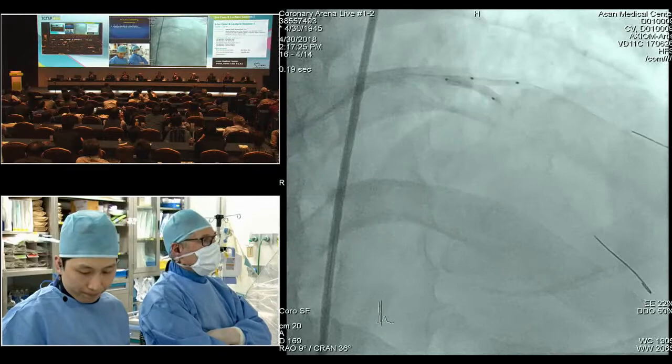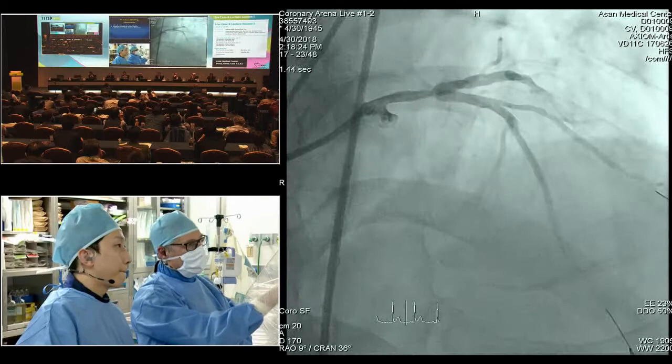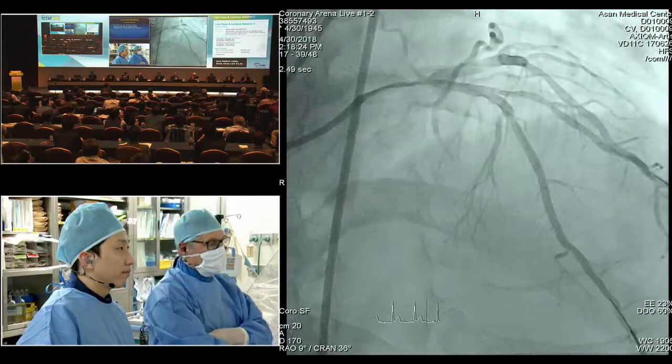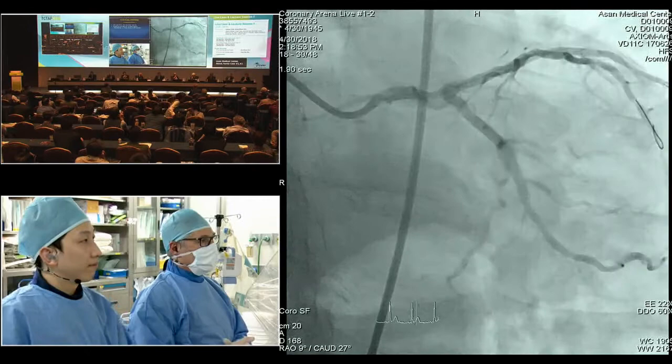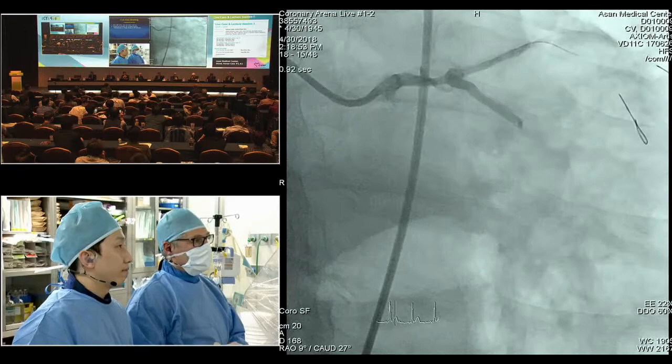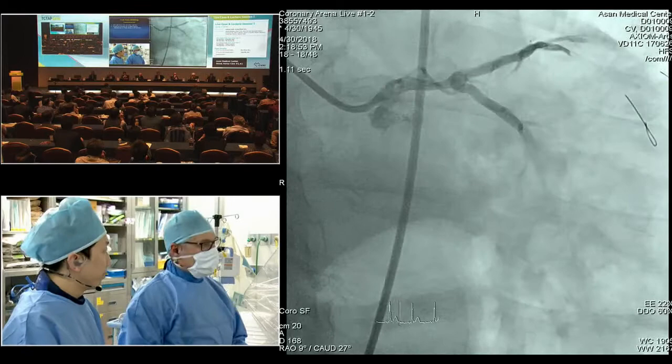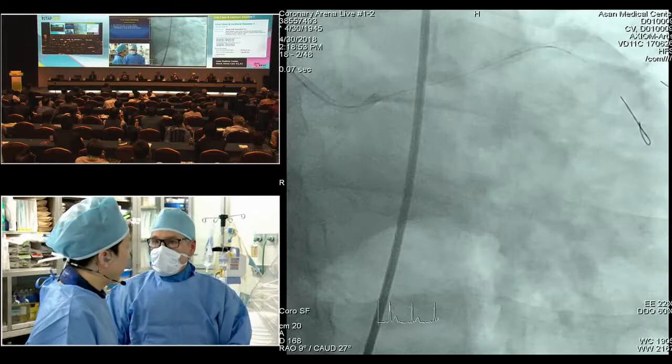Of course, there is a difference in size between the left stent in the mid LAD, but because of the bridge, we don't want to touch more distally this LAD. So now we'll focus on the left main. This is a working view, and the strategy will be quite the same. Predilatation with a non-compliant balloon to be sure that we really open the plaque which is calcified, and then provisional side branch stenting approach. So we can use a non-compliant balloon 3.0.